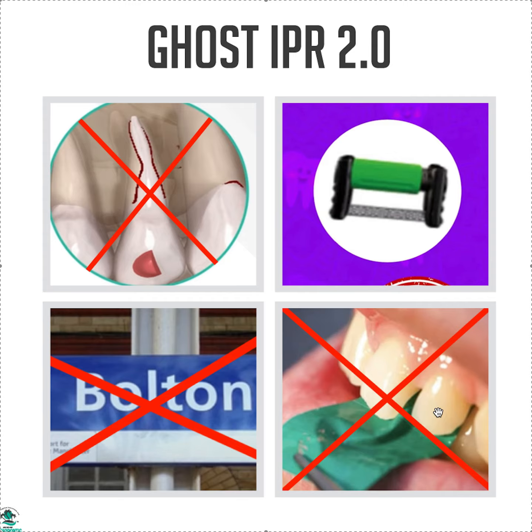We need IPR because there is a tooth size discrepancy. If there's a mandibular Bolton, you're going to need IPR unless you want to do veneers or fillings on the small teeth on the top. Flip side, maybe on the upper if there was a lower one.